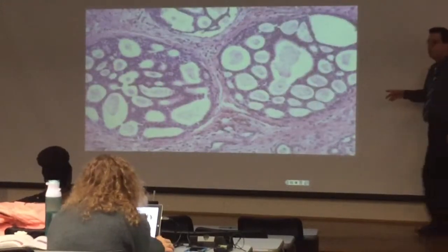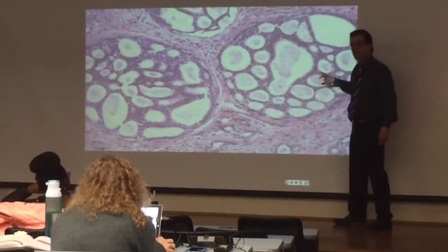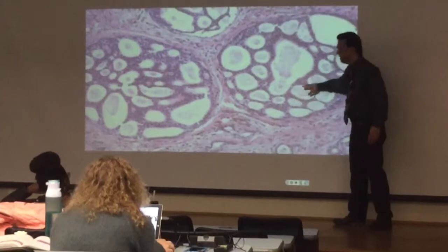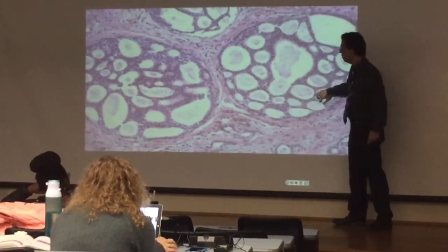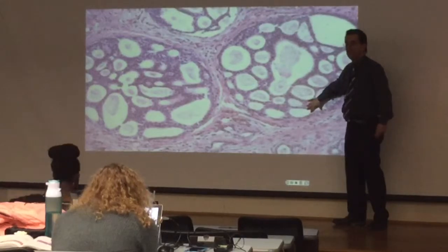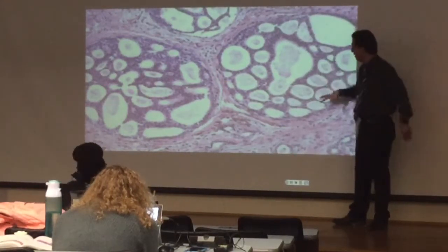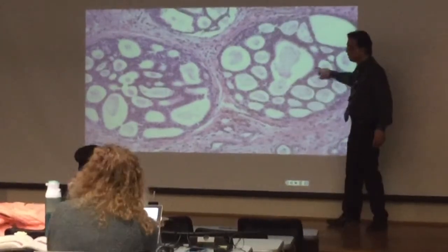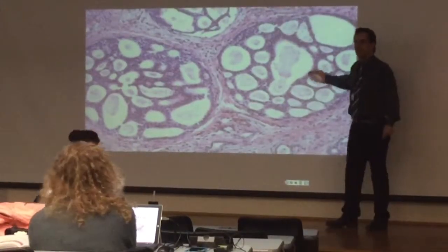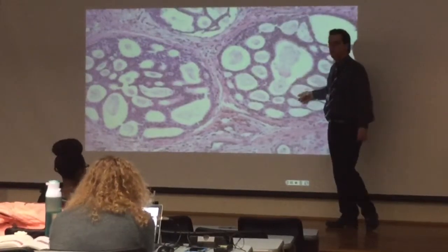This is a ductal carcinoma in situ. If you compare it with that hyperplasia, now the cells are kind of monotonous. They're all just one type of cell. Compared to the previous picture, the spaces are very orderly. You see it not only at the center, you see it at the periphery. In the usual ductal hyperplasia I showed you in the previous picture, the spaces were irregular. Here it becomes very monotonous, very regular, kind of cookie cutter, as they call it. Based on the grade of the nucleus, they range from low grade to high grade. So this is a low grade.